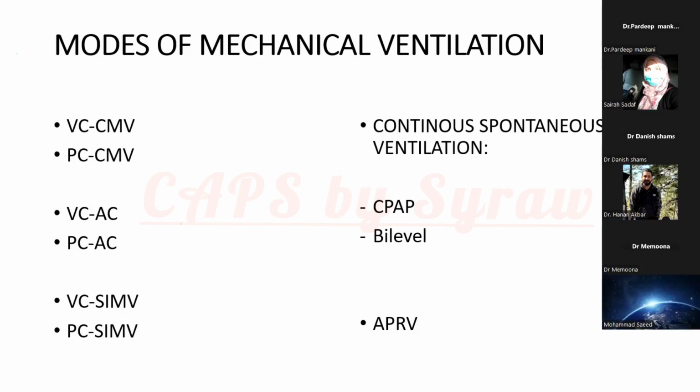Ma'am, with your permission, Dr. Danish, I'm working here in the Royal Hospital, Muscat. We are using this mode, pressure control volume guaranteed, in almost every paralyzed patient intraoperatively. And secondly, we use another mode as well, pressure control volume guaranteed with SIMV. Both are added in the same procedure and same mode, in case the patient has its own breath, it will be synchronized by the ventilator, so we avoid any asynchrony between the ventilator and the patient.